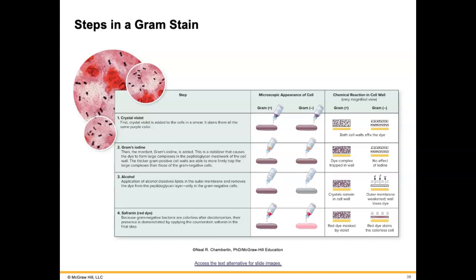If you have an infection in your blood, and we do a gram stain, obviously the bacteria has to grow for a little bit in the bottle, and when the bottle comes up positive, then we will do a gram stain on that. And when that happens, it's a fairly quick turnaround time once we do the gram stain.